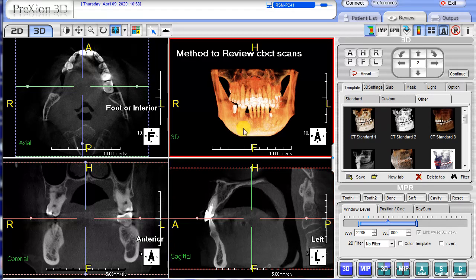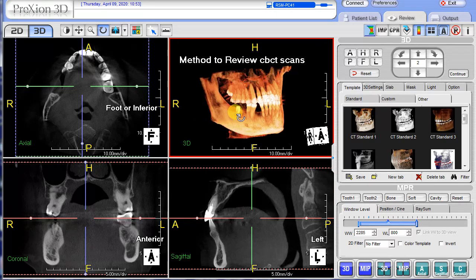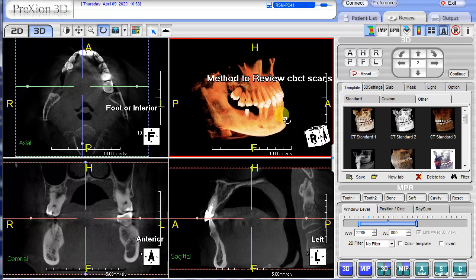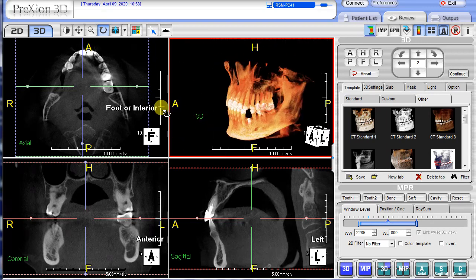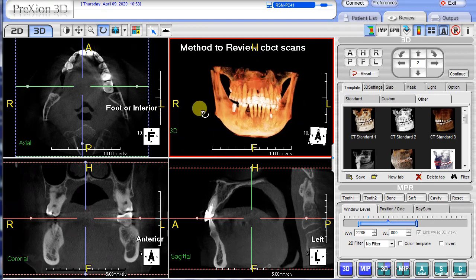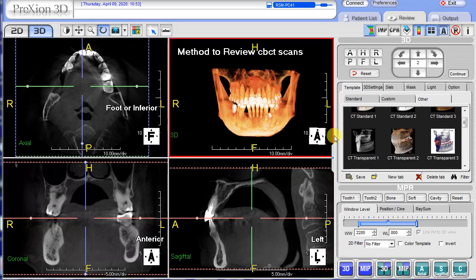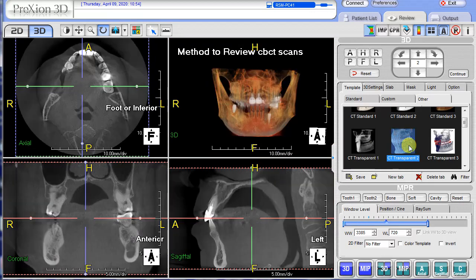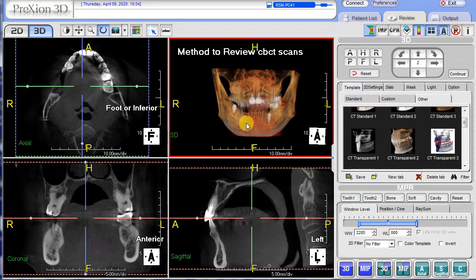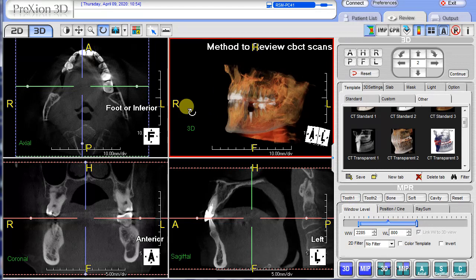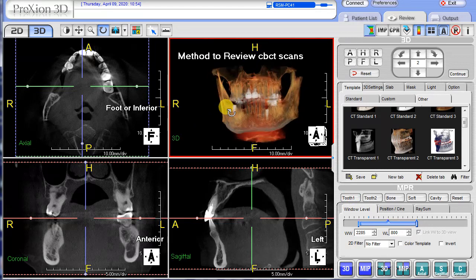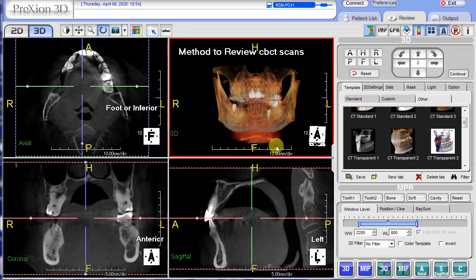To start, just left click your mouse. See that curved arrow? You can rotate around to the 3D — there is the right side and there is the left side — just for a quick overall evaluation from your volume rendered imaging. You may click on a transparent template on the right to get a better view of internal structures on the 3D rendering. If you are using a touch pad, use the curved arrow on the toolbar and use your touch pad for rotation.